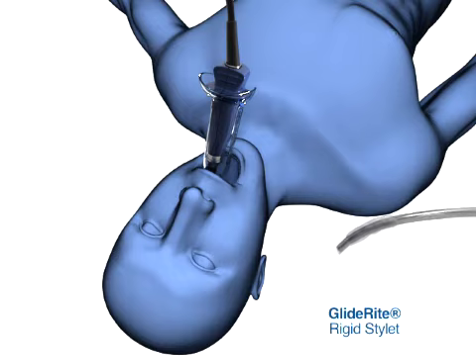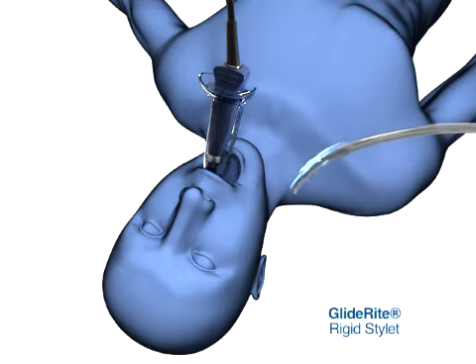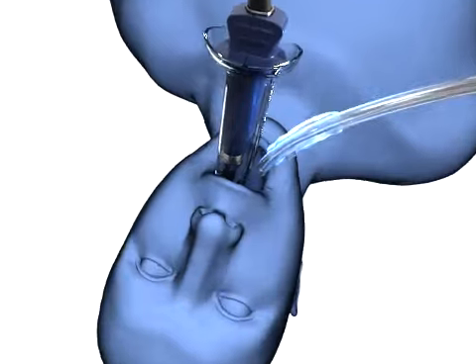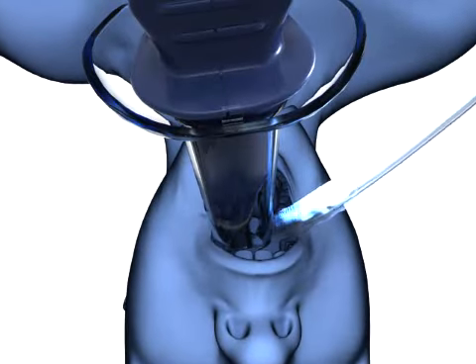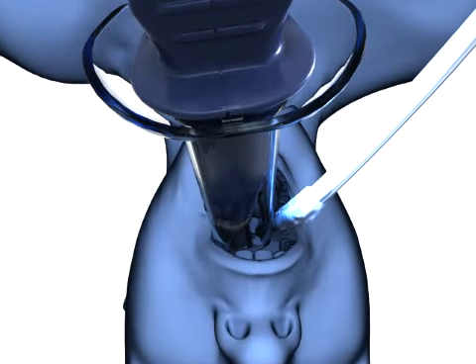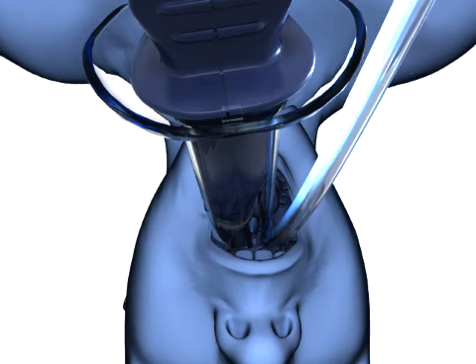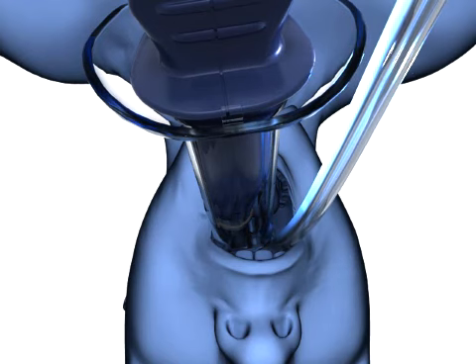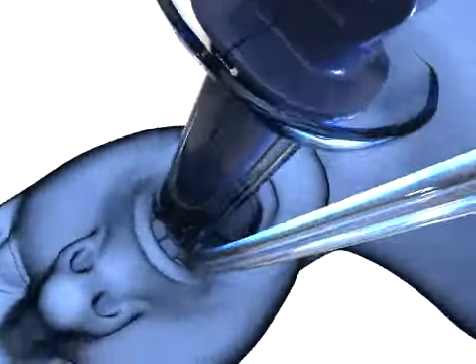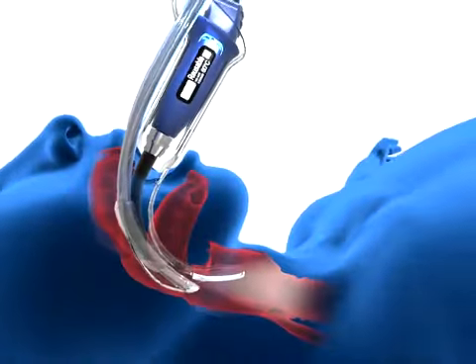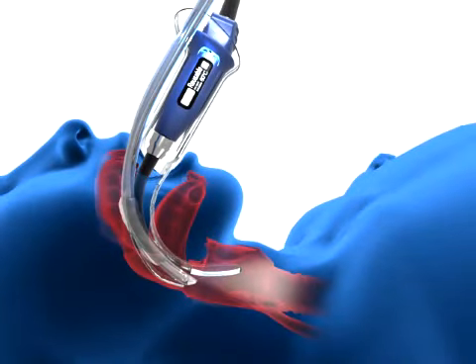The endotracheal tube, which in this case is shaped by a glide-right rigid stylet to complement the angle of the Glidescope Video Laryngoscope, is inserted under direct vision until the distal tip of the tube is very near the distal tip of the laryngoscope. This relationship is quickly and easily achieved, and only then should you return to looking at the video monitor.